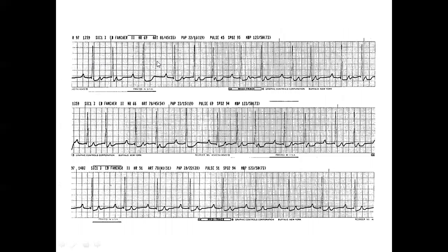Well, unusual, 2 together, 3 together, 2 together, 2 together. Then becomes regular. Is this sinus bradycardia? No. P's are occurring regularly, short, long, blocked, short. Well, there must be P hidden somewhere there. You have to find out from the caliper. Okay, here, must be somewhere hidden here. And that's the one that's blocked. Then new cycle begins, a short, long, longer, blocked. 3 to 2, 4 to 3, 3 to 2, 3 to 2.